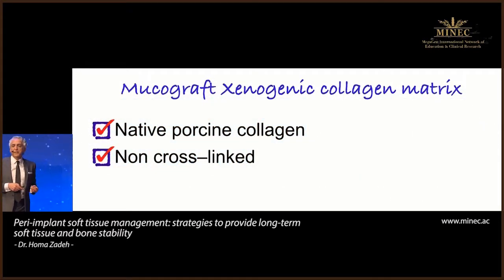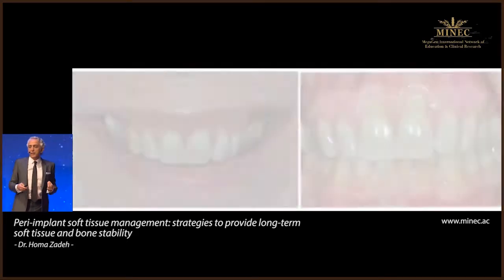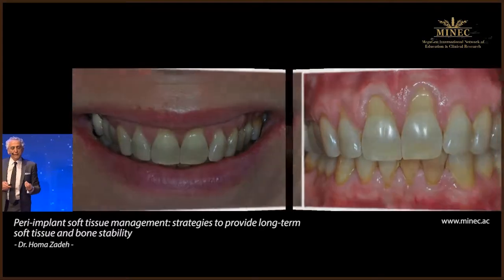So can we use other material like xenograft? This is mucograft, using it with Vista. This is a patient who had a lot of recession on her teeth.